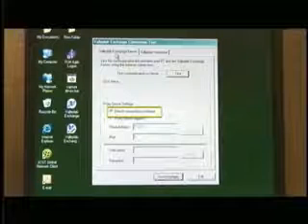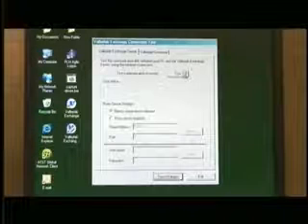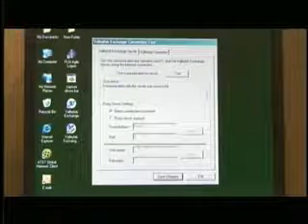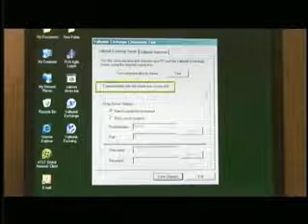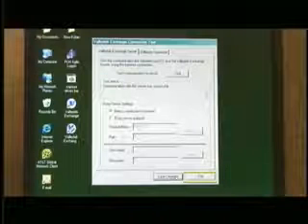If you choose Yes to check the connection, this screen appears and will have direct connection to Internet options selected by default. To test your connection, select the Test button and the communication link will be tested. If there is a good communication link, the test status will indicate communication with the server was successful. Select Exit to close the utility.